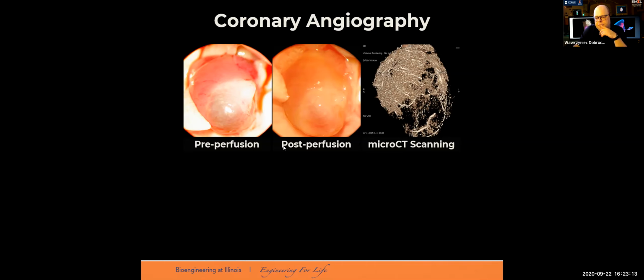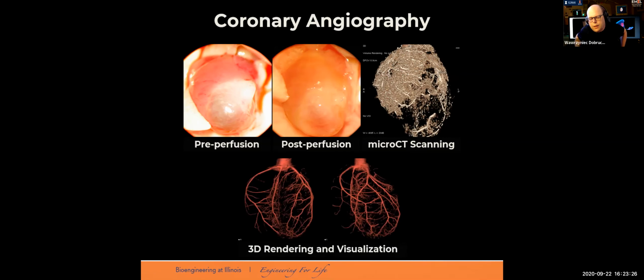And then, if you have this micro CT scan shown over here on the right side, to improve the quality of this image you need to apply a lot of processing. We were able to apply that processing using the advanced workstation and show the images on the lower part of the screen, where you remove all the artifacts from the image and focus only on the vascular tree in the mouse.